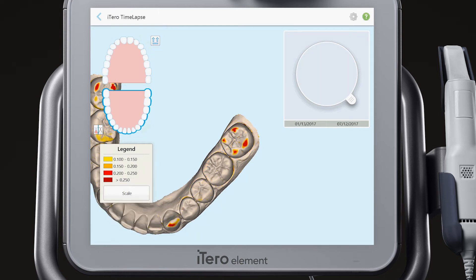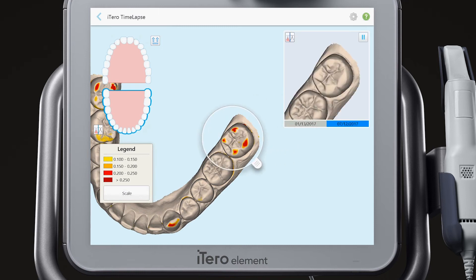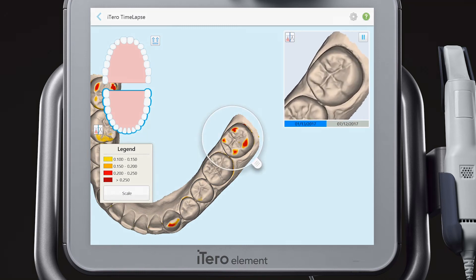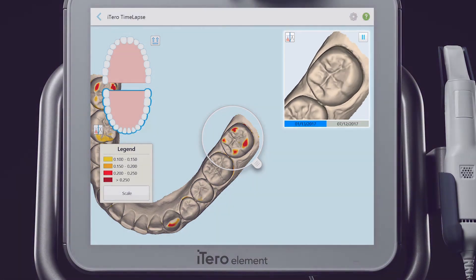Bring the loop to the area of interest. View the changes in the animation window in the upper right corner of the screen. The animation alternates between the two selected scan dates.